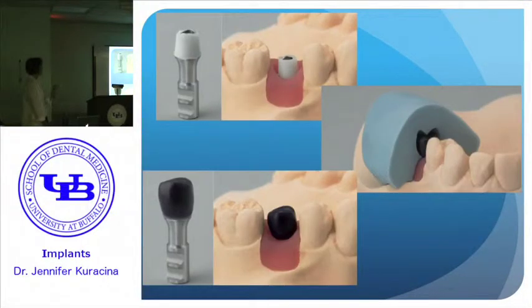It's important, I know our technicians know this, but you need to tell your student that when they're communicating with a laboratory in the future, you don't want them casting that little thimble as the substructure for their crown, because how many times have you seen this from inadequate metal support over these prefabricated abutments? So it's important that they send their wax up to the laboratory, they can index it, they can wax in appropriate support for the porcelain.